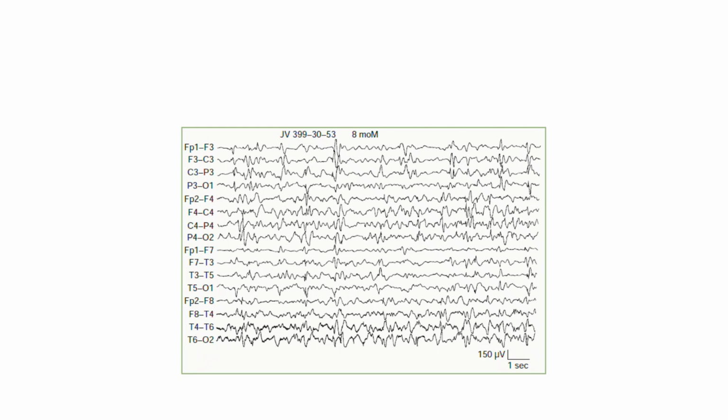3. Why this pattern is an electrographic emergency. Hypsarrhythmia does not just represent a high seizure burden, it signifies continuous, widespread cortical dysfunction during a critical window of neurodevelopment. This relentless, chaotic electrical storm acts as a massive barrier to normal synaptic plasticity.